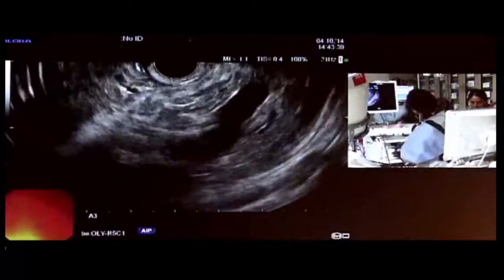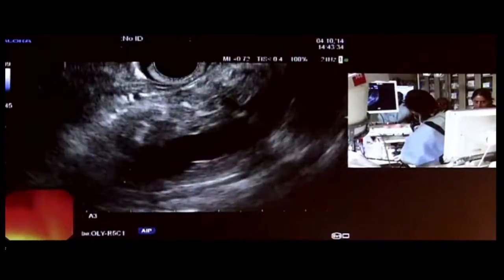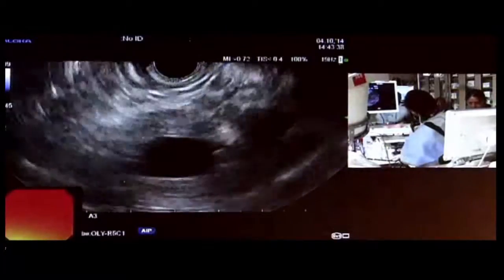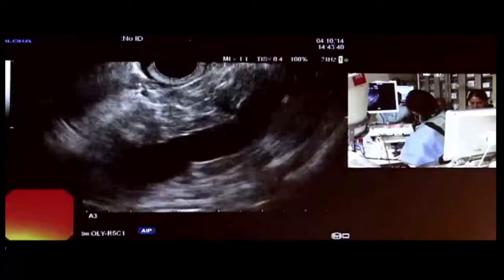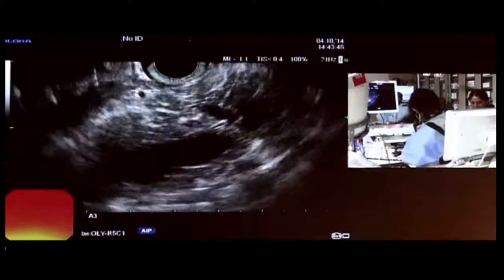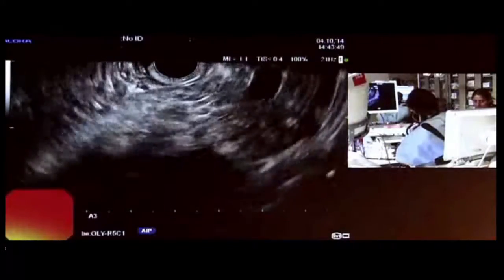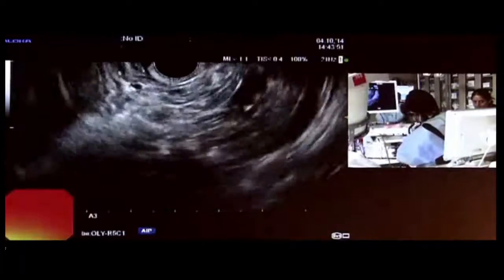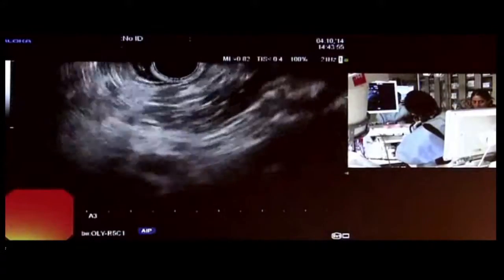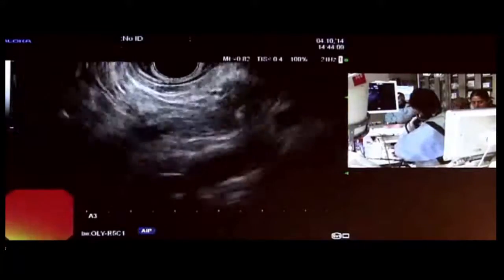And indeed, this is a very dilated PD. And there's no vascular signal in there. Yeah. And her pancreas looks very viable, right? I mean, she doesn't have atrophy, she doesn't have calcification, she doesn't have any changes of chronic pancreatitis. She just has this very dilated duct that goes all the way to the tail there. And I just lost it because there's the splenic hilum.